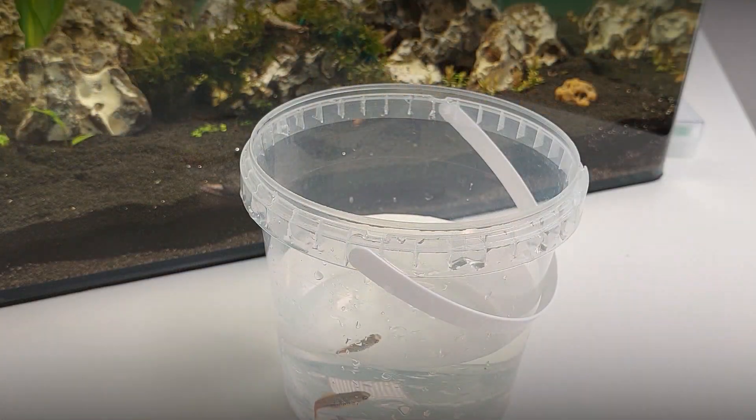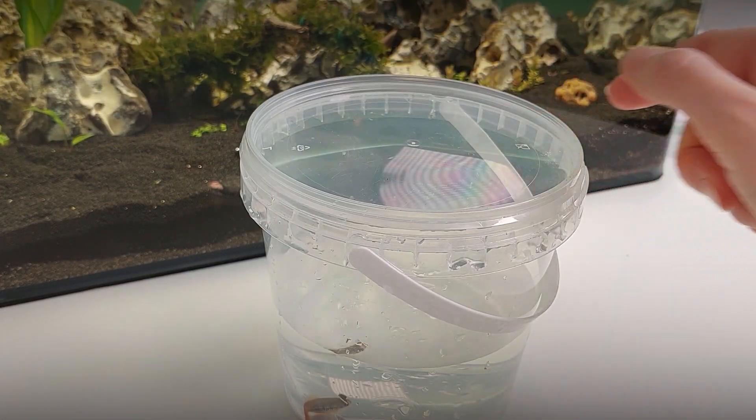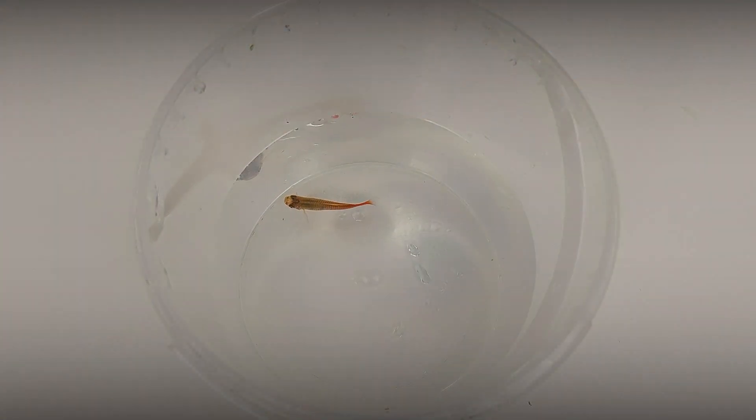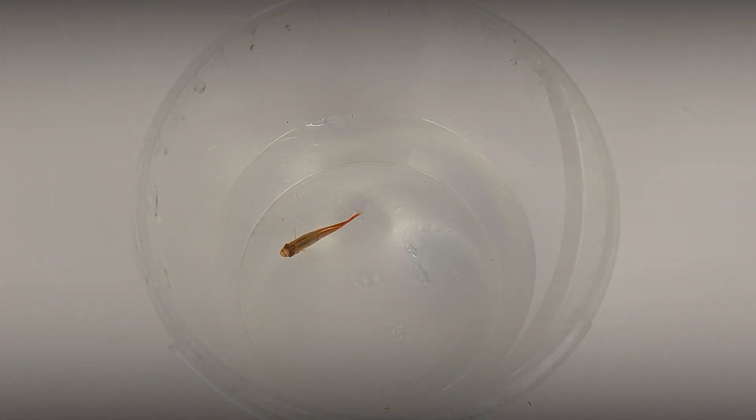Put a cover on top to prevent the fish from accidentally jumping out. Most fish will be agitated at first, but calm down quickly. Sometimes it may be necessary to use a light sedative.